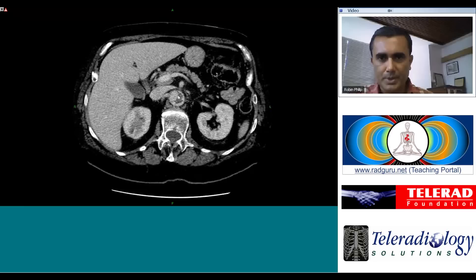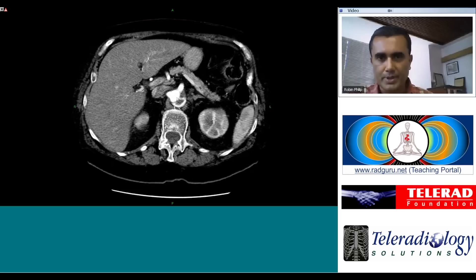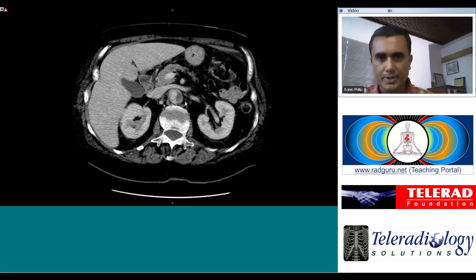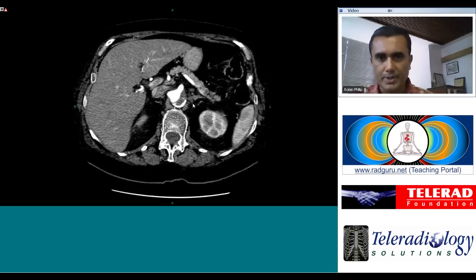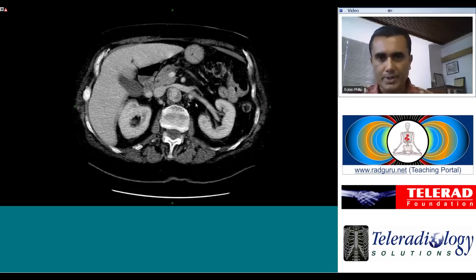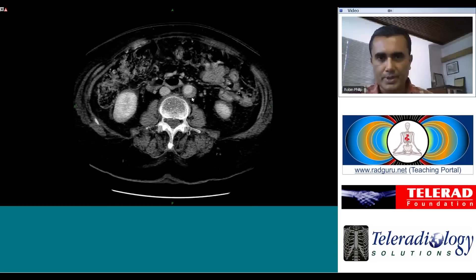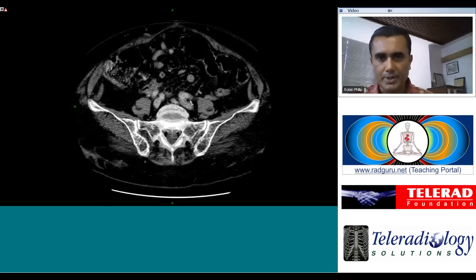Again, this is the true lumen and this is the false lumen. The right renal artery is coming off of the true lumen and the left renal artery is coming off of the false lumen. Moving further down, we see that the dissection flap also extends into the left common iliac artery.